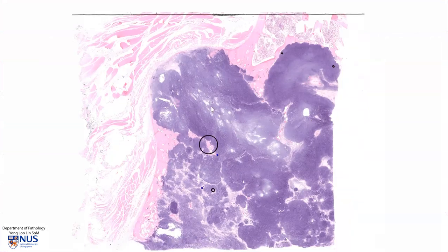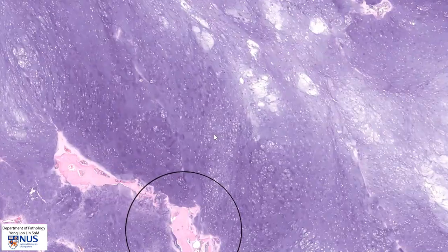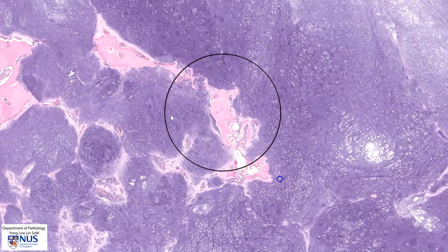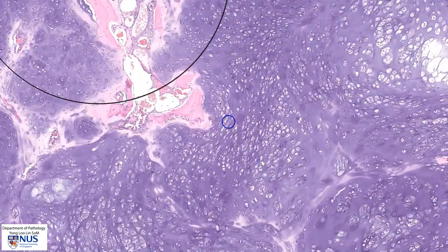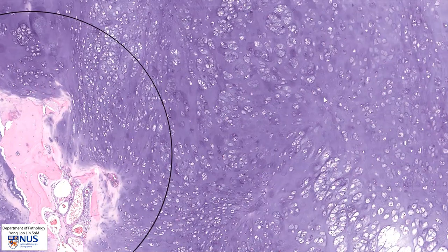In summary, this is an example of a chondrosarcoma, which is a malignant cartilage-producing tumor, involving the scapula. We have areas of variable cellularity with some areas showing relatively high cellularity and other areas showing quite low cellularity, and we have a moderate degree of nuclear pleomorphism throughout the tumor.